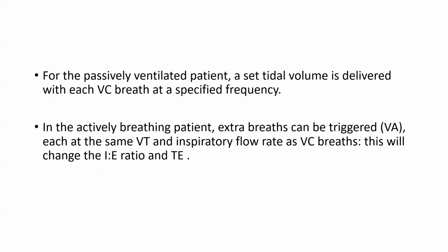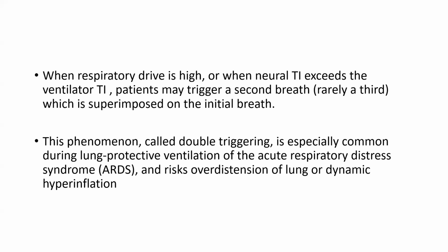For a passively ventilated patient, the set tidal volume is delivered with each volume control breath at the specified frequency. In an actively breathing patient, extra breaths can be triggered, each at the same tidal volume and inspiratory flow rate as a volume control breath, and this will change the I:E ratio and expiratory time.